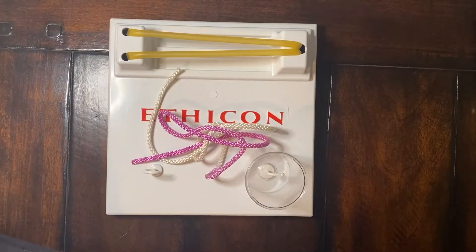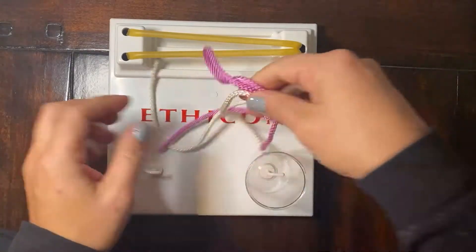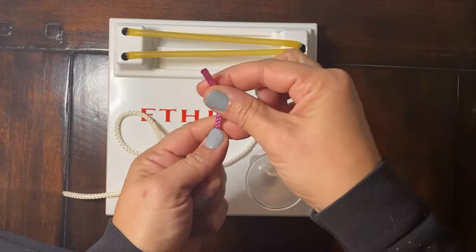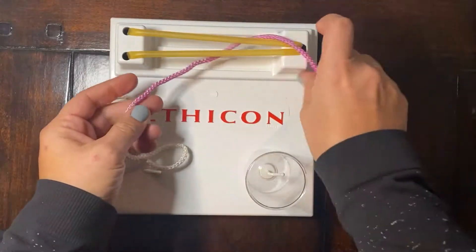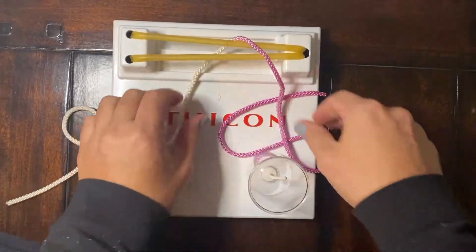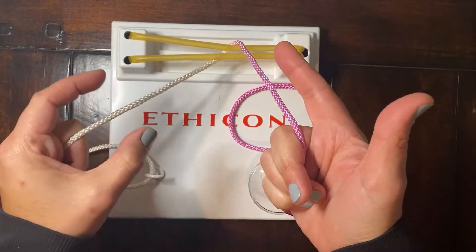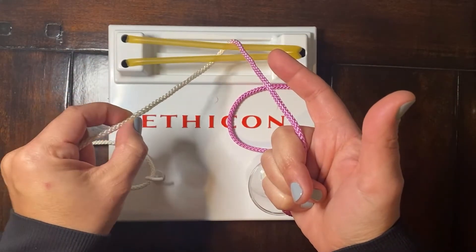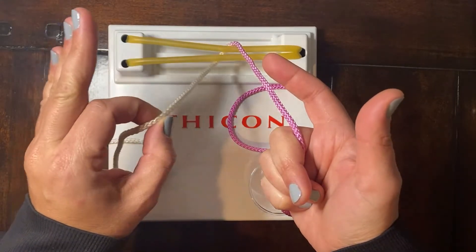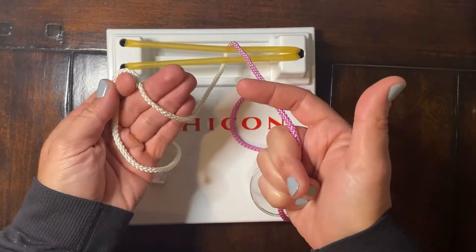I know there's some lefties out there, so let's do a single-handed knot tying technique left-handed. For this, we're going to pass our needle end, the purple end, under, and hold that in our right hand as the post. Technique is the same. We start with our pistol grip. Left index finger and thumb will pinch the suture, and the last three fingers will come out, over, and down to karate chop your suture.